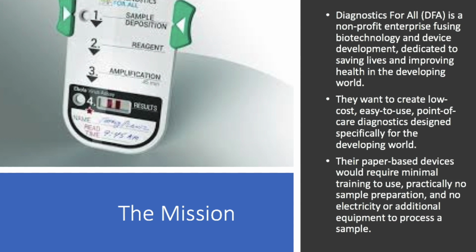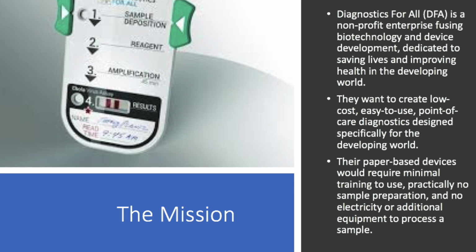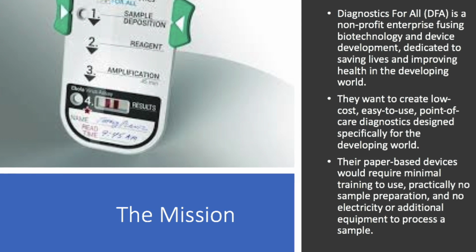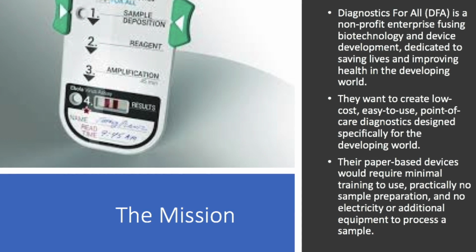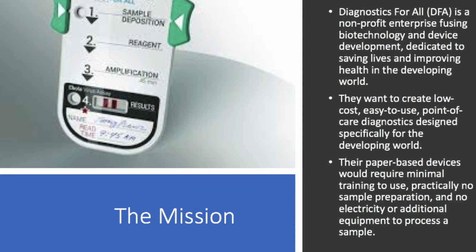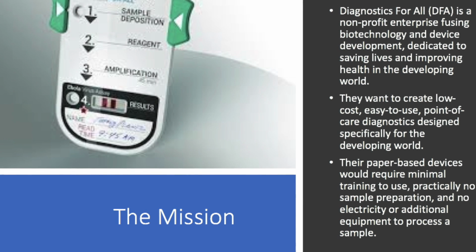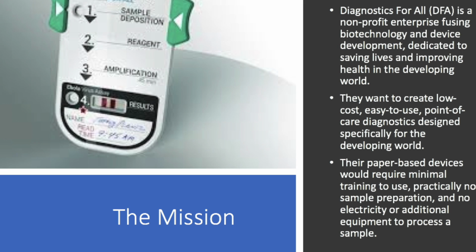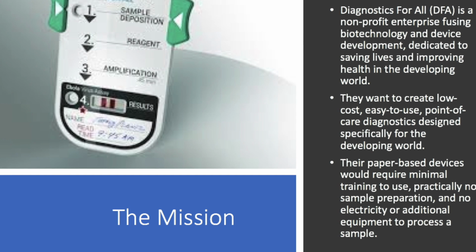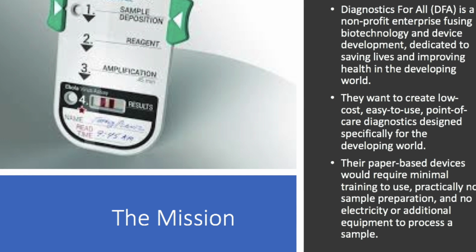Their paper-based devices require minimal training to use, no sample preparation, and no electricity or additional equipment to process. So it's very on the go, and the whole process takes about 45 minutes to an hour. So they can easily do this in villages and where people might not have the time or the energy to go to a medical professional and wait for results.